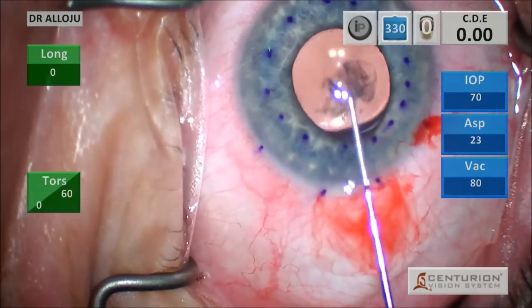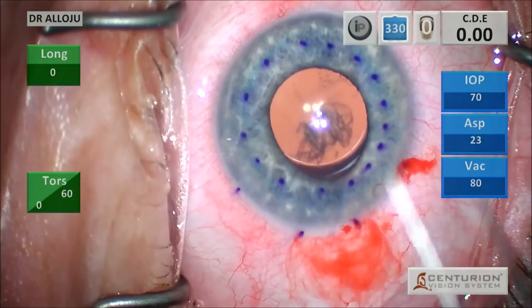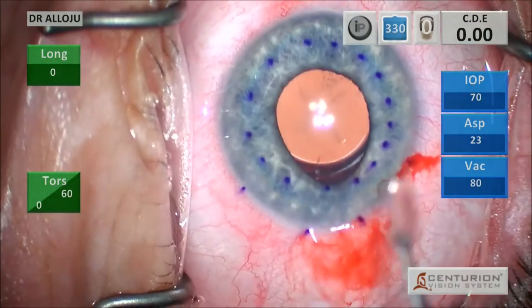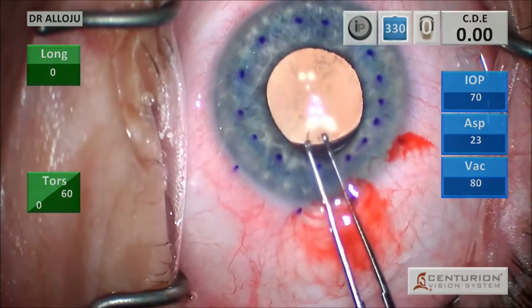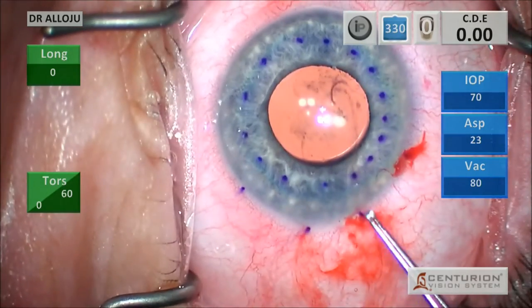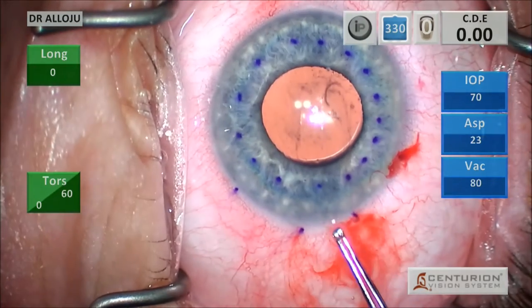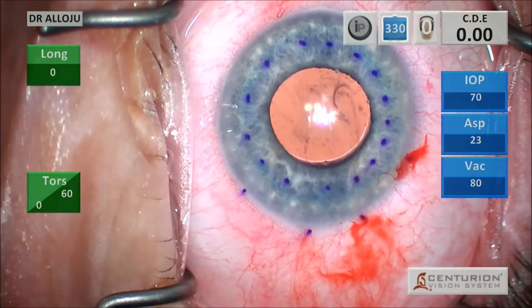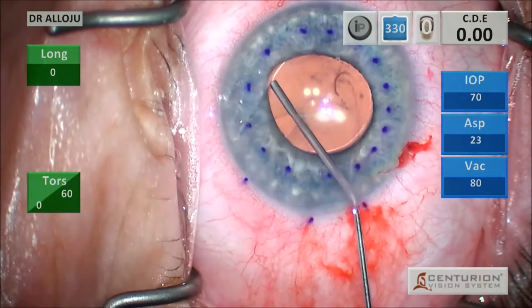Now one instrument that I've really liked is the Straiko forceps, which have a twin ring design that really kind of allow you to grasp tissue in an upward fashion here. I also like to go back in and make sure I grab any leftover remnants. And here I've identified a small remnant right inside the stripped area. So I'm basically going back in and grabbing it. Again, this is really crucial to help with graft attachment.